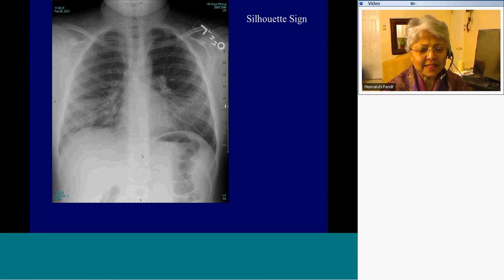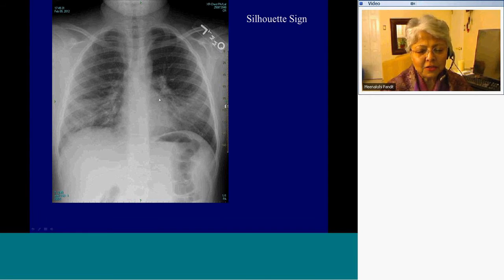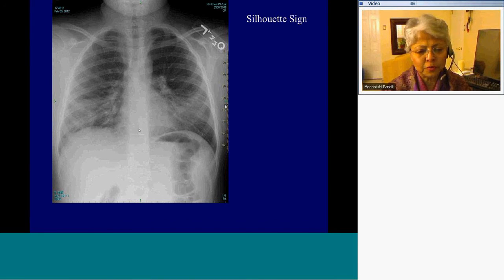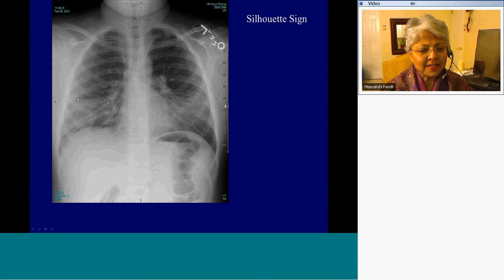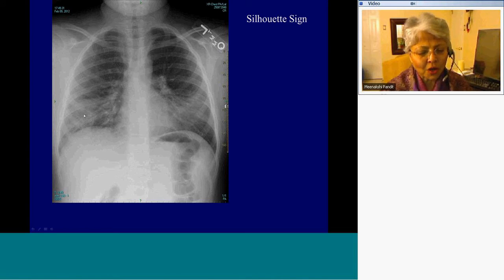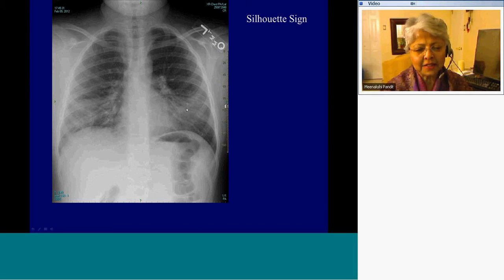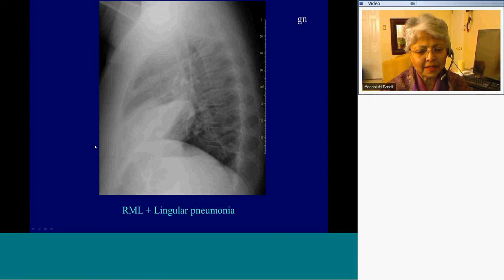Here's a simple example of pulmonary consolidation — silhouetting of the left heart border. It would be inappropriate to report this as left basal pneumonia or left lower lobe pneumonia; this is in the upper lobe, in the lingula to be specific. On this view, there's delineation of this opacity by the minor fissure, and we know that the right middle lobe is in contact with the minor fissure. So this is a middle lobe and lingular multilobar pneumonia, and that's confirmed by the lateral view.